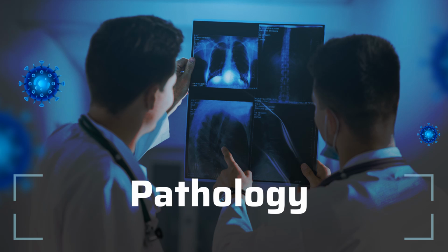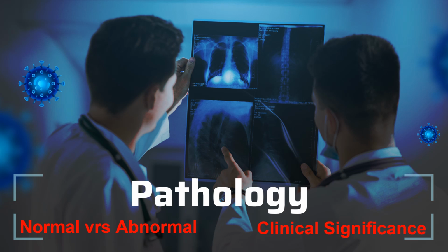This module will discuss the appearance of several commonly found pathologies. You will compare and contrast the normal from the abnormal findings on chest X-ray. The clinical implications will be expanded from case studies that will be presented.